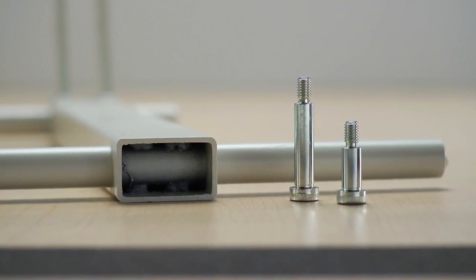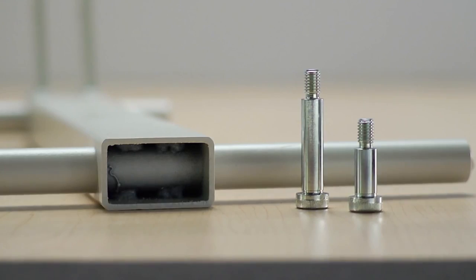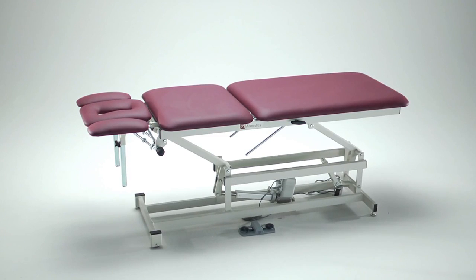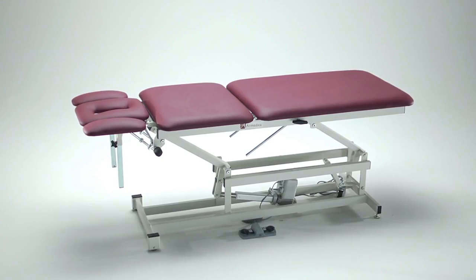The table is constructed with heavy 11-gauge steel tubing, and all pivoting joints have hardened steel shoulder bolts. The AM555 features a 27-inch wide by 76-inch long top surface with three sections that are used to place the patient in the ideal position needed for most treatments.